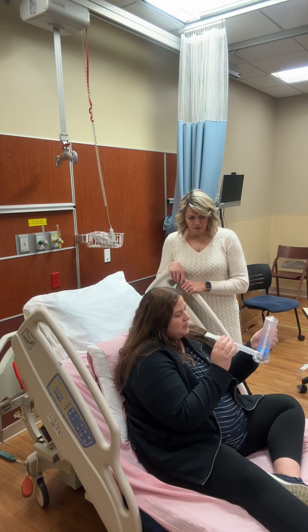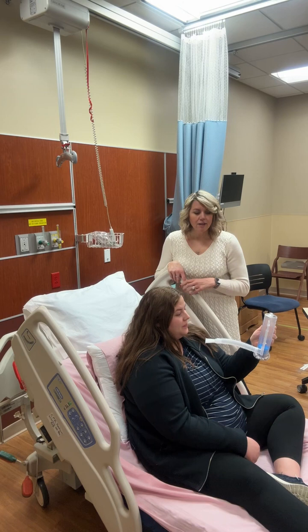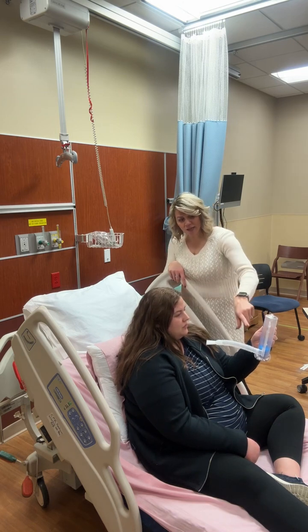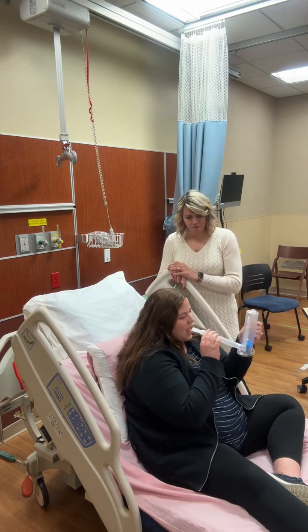It didn't go up. Yeah. So the goal is to inhale. You blew out. That's why nothing moves. Oh, yeah, I was blowing it. Okay. So why don't you take a slow, deep breath in. Try to keep this in between the arrows. Kind of levitate. You'll see it move, and then this will move up for you. Okay.